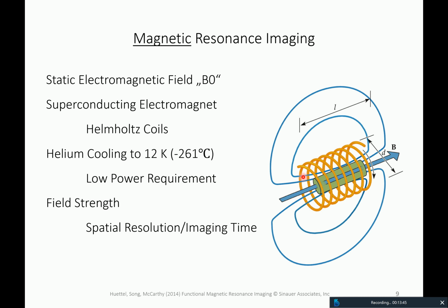You will have heard already last Wednesday when Rainer Göbel gave his talk that there are and have been scanners of different magnetic field strengths. So in the 90s, 1.5 Tesla scanners were kind of the norm. Then in the 2000s, and actually until now, 3 Tesla scanners are the norm.